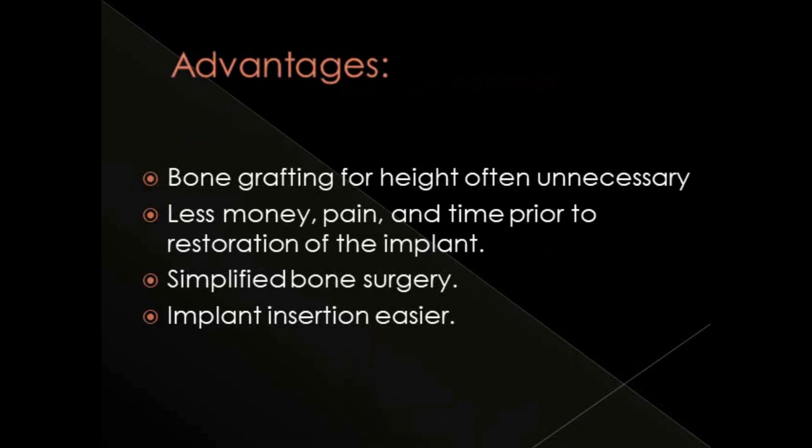Let us see the advantages. Here bone grafting is not necessary, and there is less money, pain and time prior to restoration of the implant. This is also a simplified bone surgery, and implant insertion is also easier.